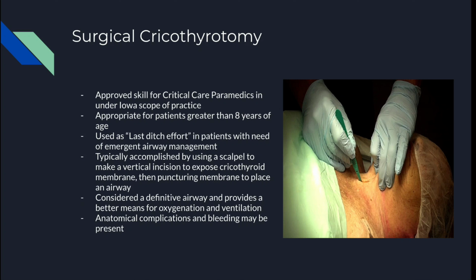So this obviously is something that we really need to use our best judgment on. So that last ditch attempt in the patients that need emergency airway management. As we mentioned, going through that algorithm, this really is that last effort to get an airway for a patient. So oftentimes this is going to be not only a dire skill that needs to be accomplished, but it's also going to be a very high anxiety type of situation.